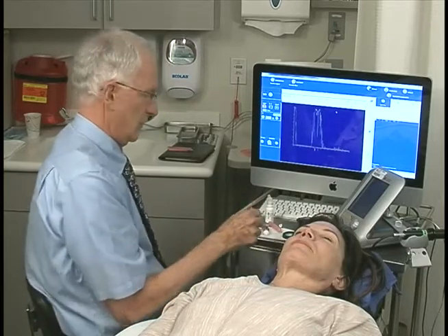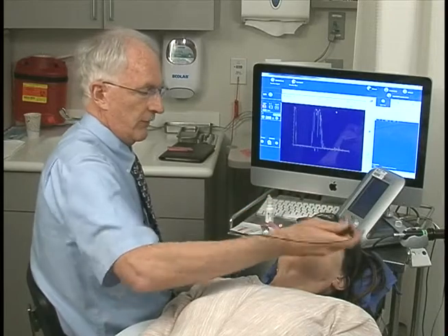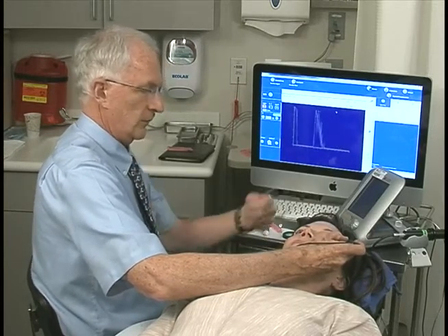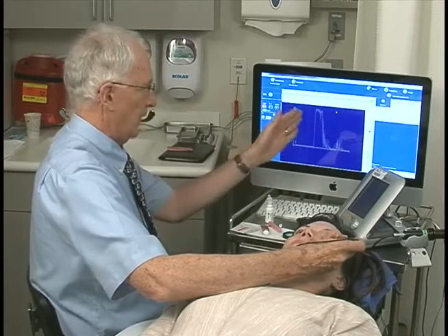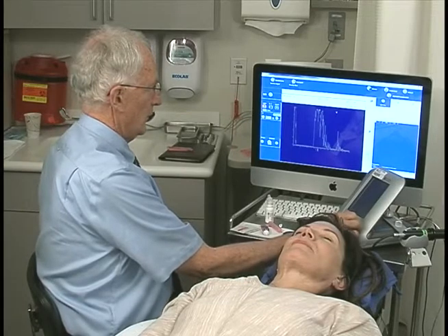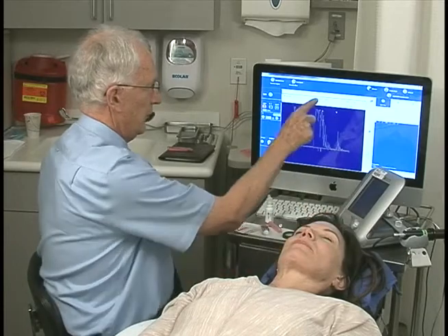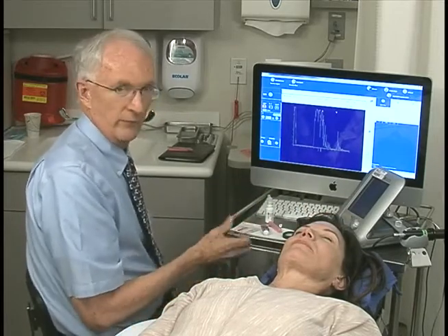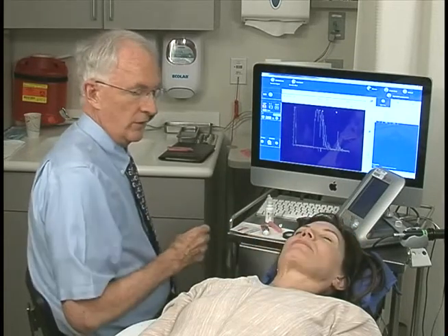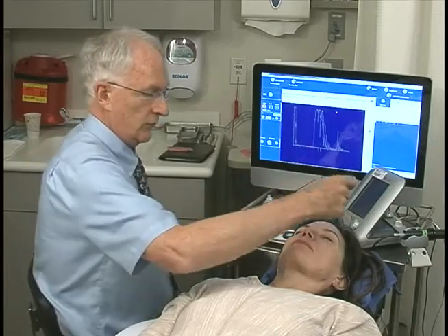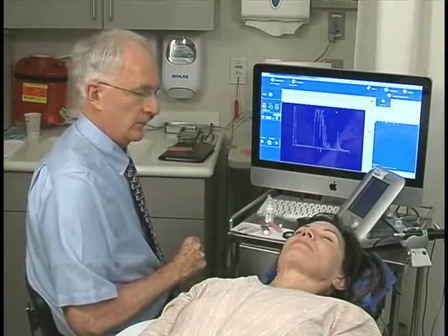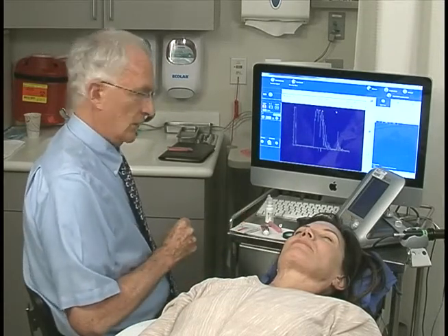So I measure the four rectus muscles. I can also measure the superior oblique muscle by placing the probe inferiorly temporally on the globe and aiming towards the trochlea. The superior oblique muscle tends to run along the medial wall of the orbit, so it usually appears further back on the display than the other muscles — more towards the bone. I place the cursor on one sheath of the muscle and the other cursor on the other sheath, measuring 2.79 millimeters. I've now measured five muscles: one oblique and four rectus muscles. The inferior oblique muscle runs inferiorly in a hammock fashion across the inferior globe and is very hard to display — the brow is in the way — so I don't usually attempt it unless there's a question about pathology.